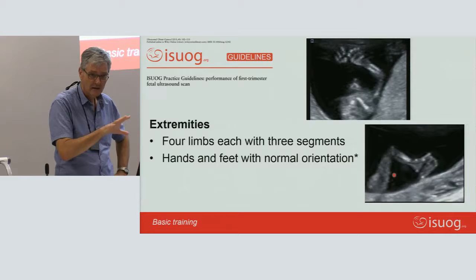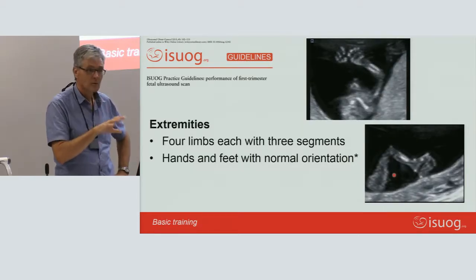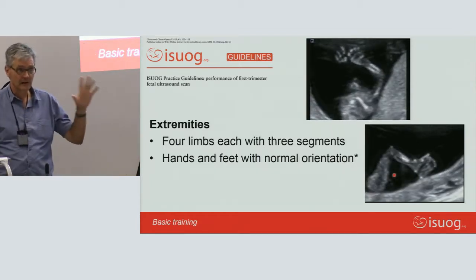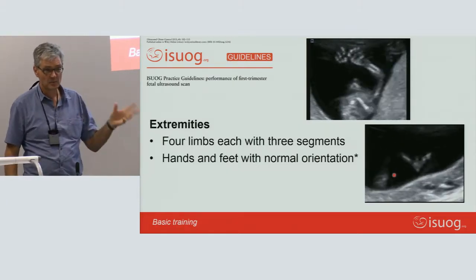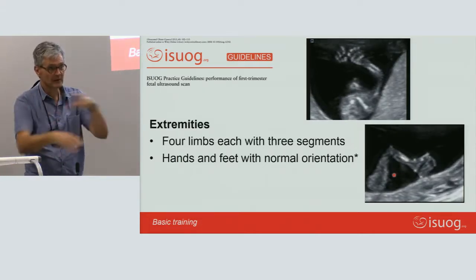this is not only gestational age and sorting out the worst of abnormalities, but also an earlier anatomical evaluation. Make sure that the hands are in a normal position and that the fingers actually open up, and the babies are usually much more obliging at 12 weeks, and you can very easily see both hands at the same time.